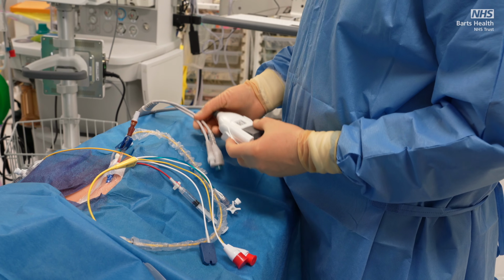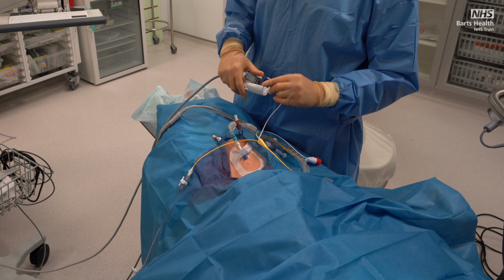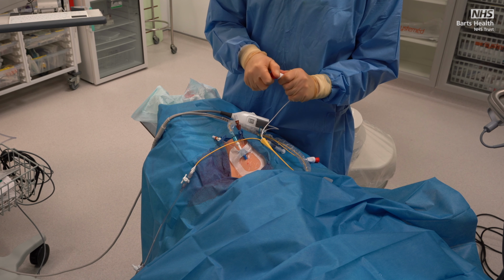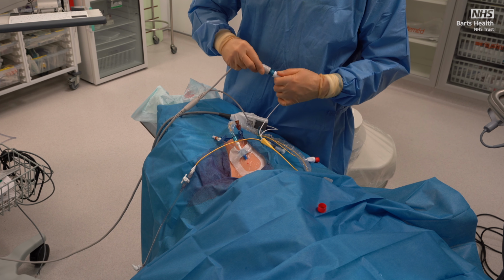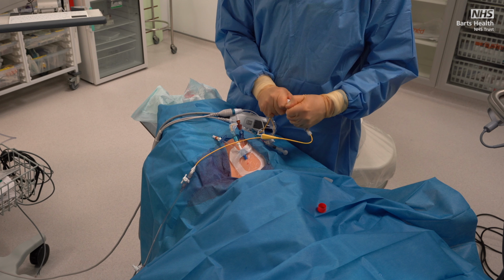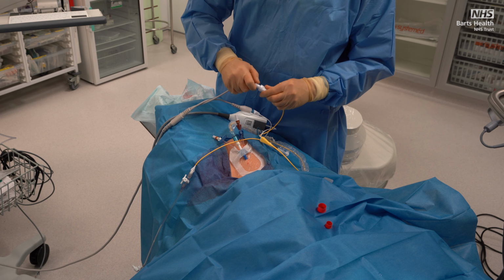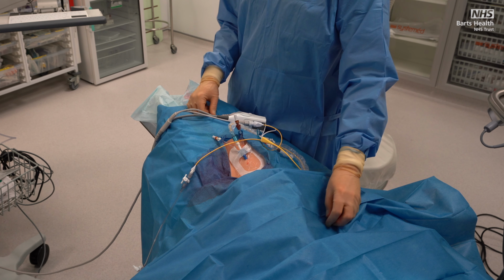Connect the catheter to the Edwards cables. There are 3 of these, one to provide power, one to provide temperature sensation, and one to provide continuous venous oximetry. Dispose of the relevant sharps and equipment.